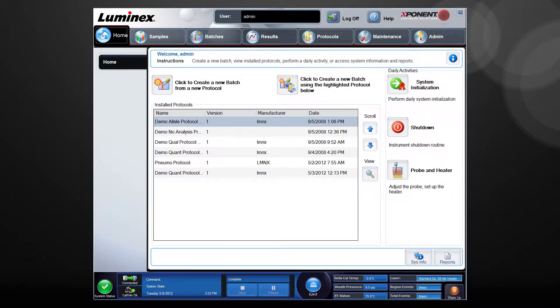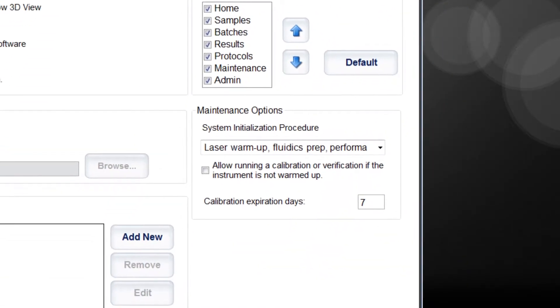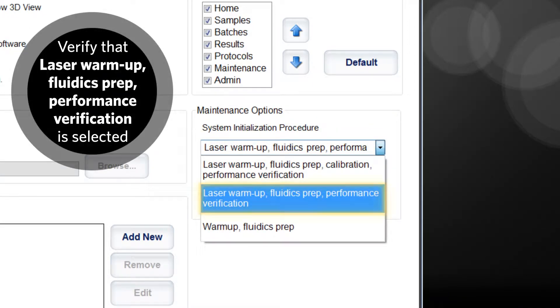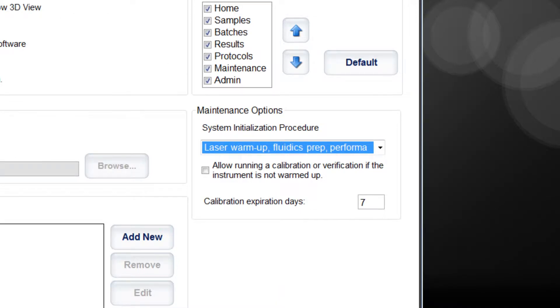To set up the system initialization settings, from the home page, click the admin tab. Under the maintenance options, in the system initialization procedure drop-down box, verify that laser warm-up fluidics prep performance verification is selected. If not, click on it to select. This sets your daily system initialization to include performance verification.